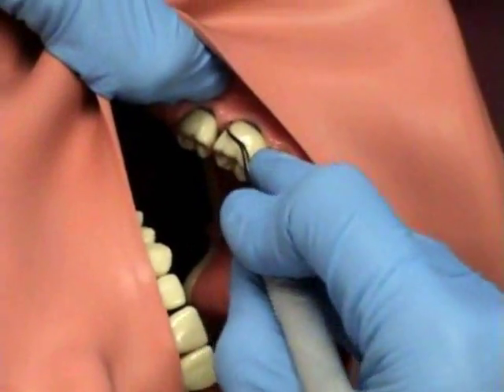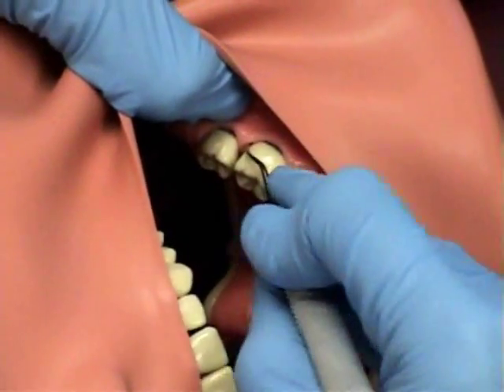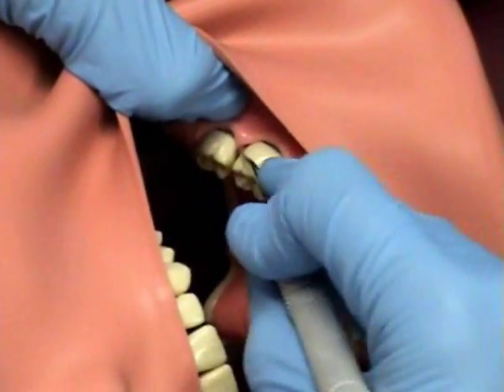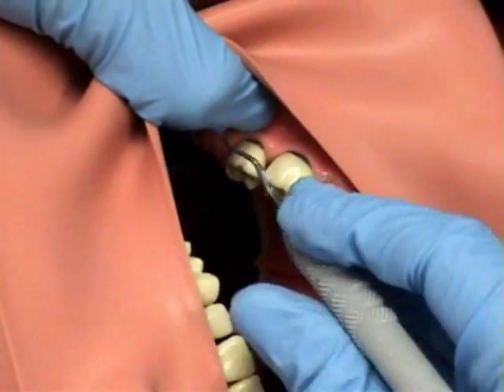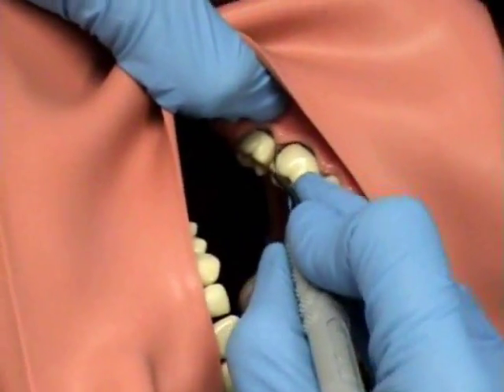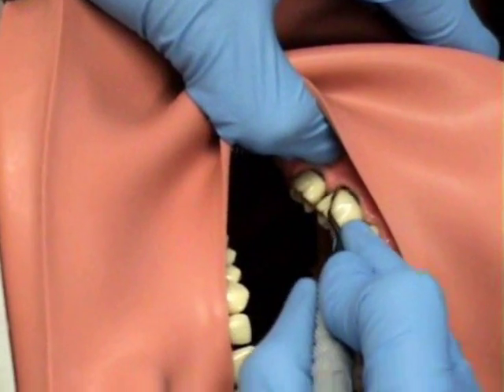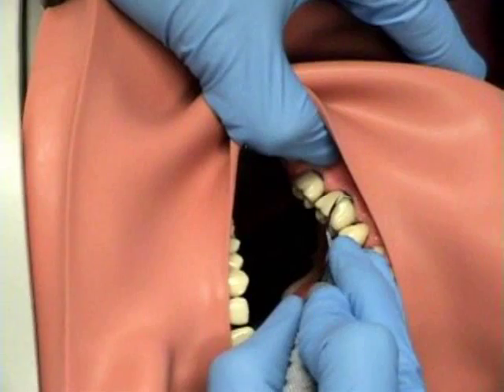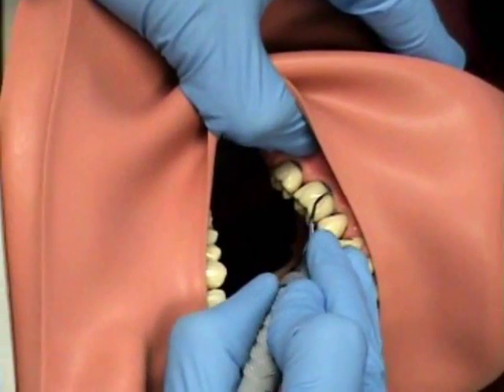Ms. Johnson is using a Langer 1-2 for the mandibular posterior teeth. The same end can be used both mesial and distal. When inserting this instrument, because the blade is honed at 90 degrees, closing the blade is more difficult. So on insertion, the instrument is more open.